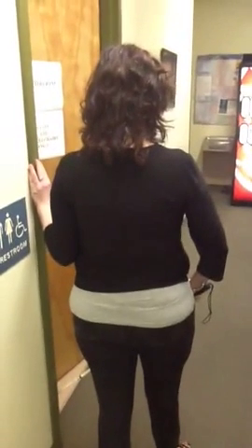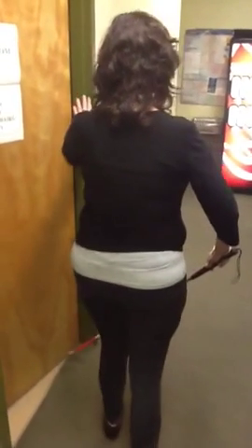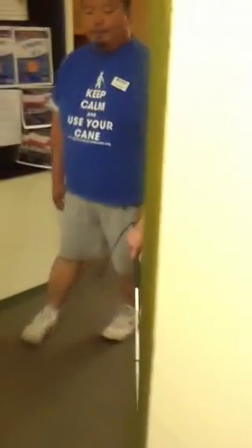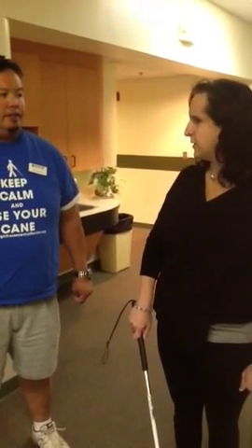Okay, this is the restroom doorway. Turn, good turn. Keep it going. That was a small conference room doorway. Okay, let's stop for a second. What was the first door that you came by? Early intervention. The second door? The restroom. And this third door is? A small conference room. Okay, let's keep going.